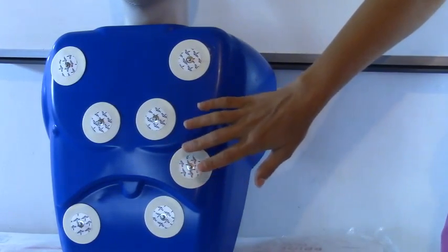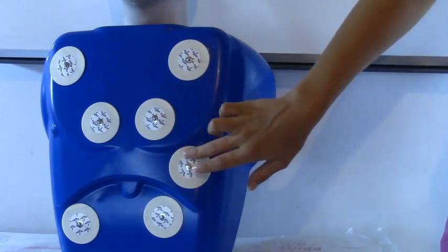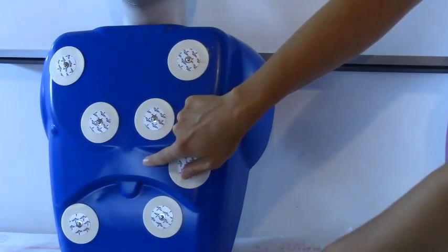And now we're ready for V3 and this is midway between V2 and V4 so V3 will be right here.